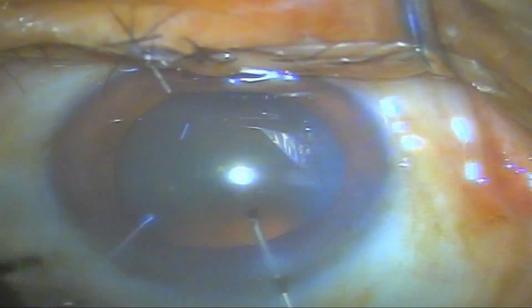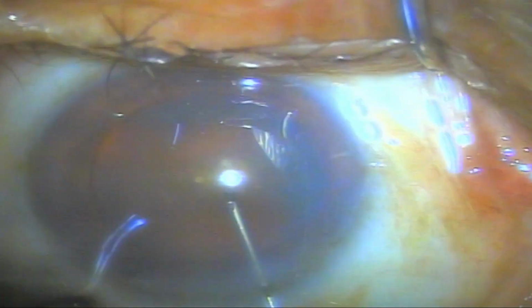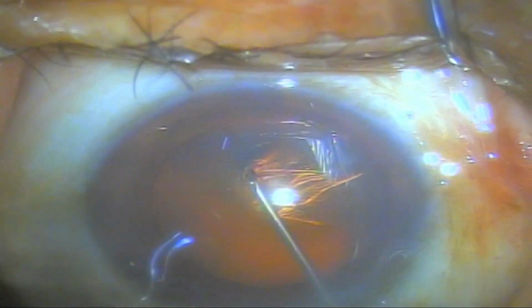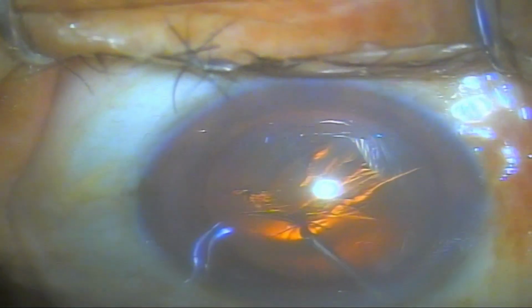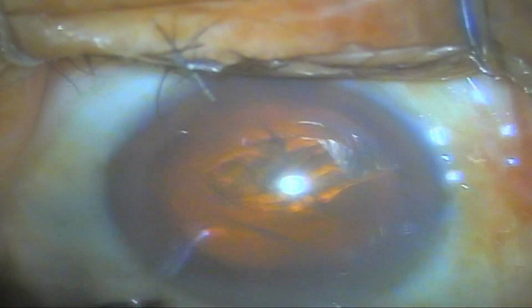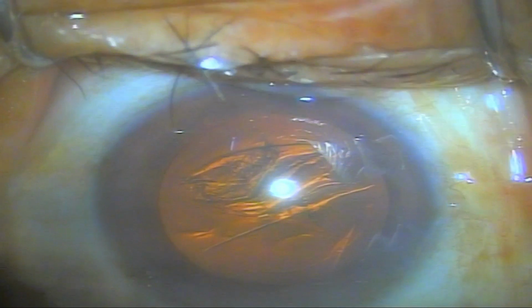I am not in favor of the use of trypan blue dye. It sometimes happens that there is a delay or incomplete irrigation of the anterior chamber after putting the trypan blue into the anterior chamber, and there are many chances of intraocular inflammation. The trypan blue dye can also lead to abrupt release of prostaglandin E2 from the iris stroma, resulting in surgical miosis. So I am not in favor of using the trypan blue dye.